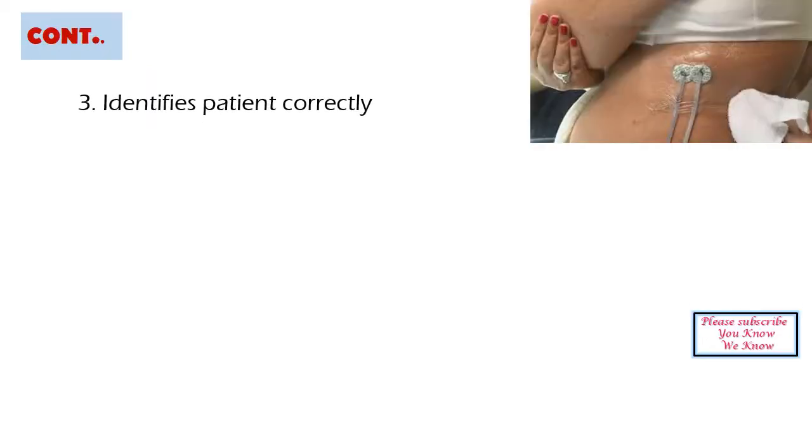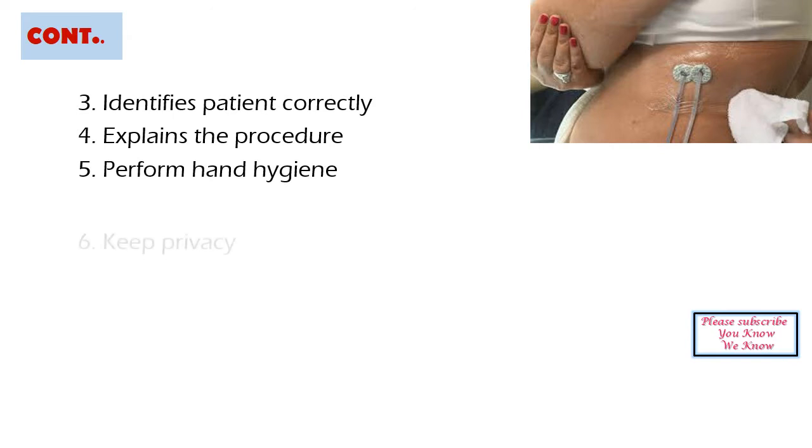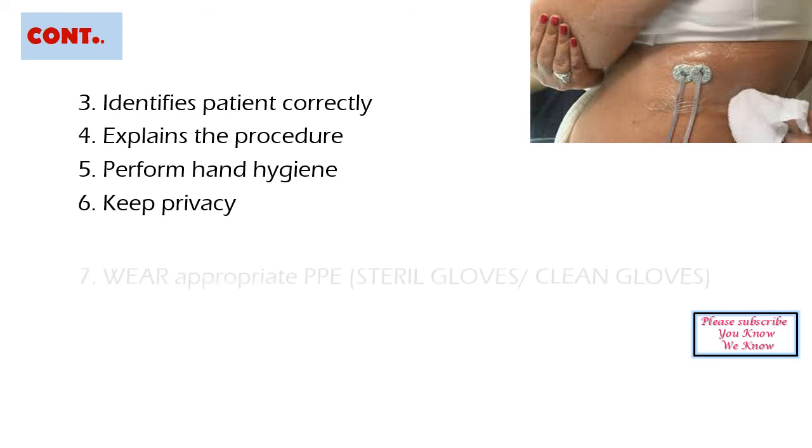Identify the patient correctly by the three names of the patient. Explain to the patient that the procedure may be uncomfortable. Perform the 5 movements of hand hygiene. Provide privacy. It gains the cooperation of the patient.